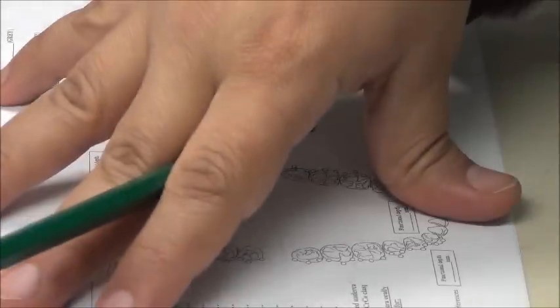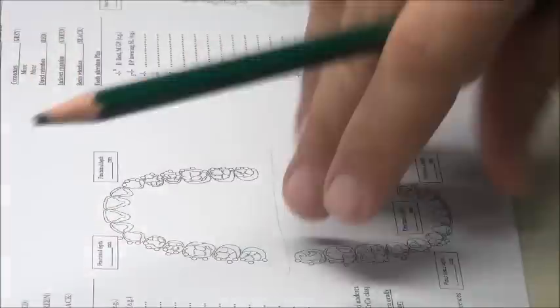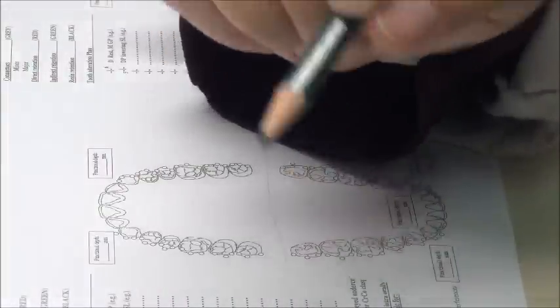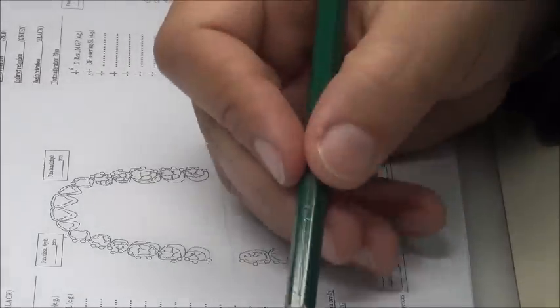So this is how we fill in this form in detail. And each bit of information, I have to write it down while doing the clinical examination, and write down my findings. During the occlusal analysis in the patient or on the articulator, I write my findings. After surveying, I write my findings. There is one here, can you see it?